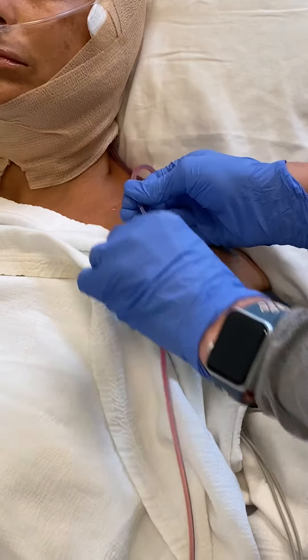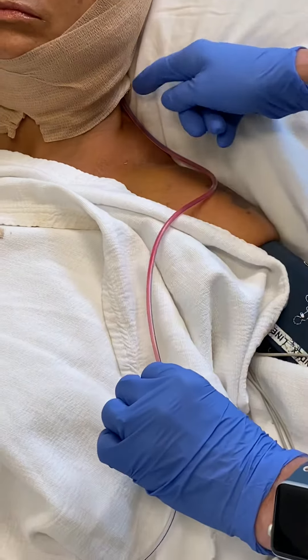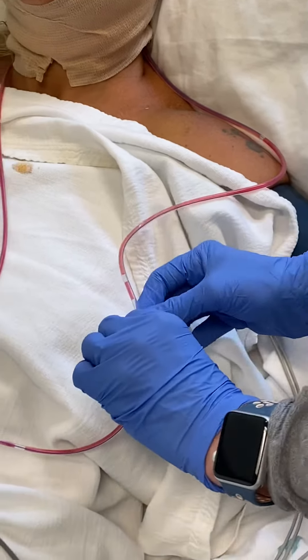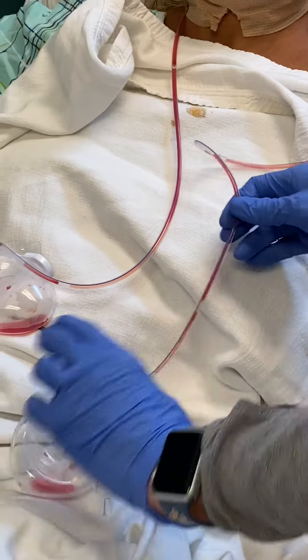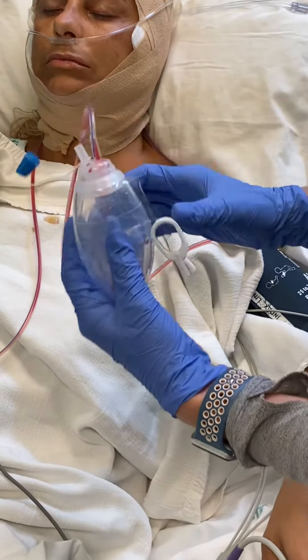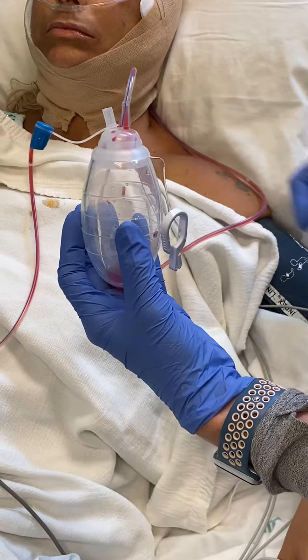Sometimes it helps to use a little sanitizer just to help it run across, but what you don't want to do is tug at the insertion site. So you're kind of holding with this hand, and then the left hand is the one that's going down. Then once you've done that, you're going to open this up and you're going to see that this drain bulb now has got a bunch of air in it.